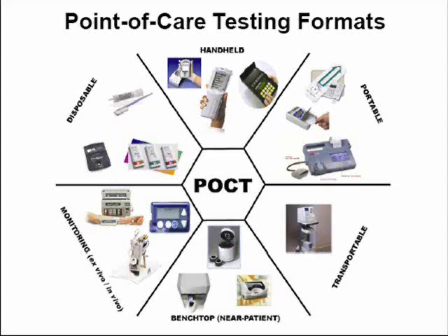Moving upwards, the little device that has a card being inserted by the user is an electrolyte point-of-care test. And then at the very top of the portable device category is a cardiac biomarker test. Again, as stated, this looks for a variety of enzymes such as cardiac troponin T or I, and these markers are released during myocardial heart muscle damage following acute myocardial infarction or heart attack.